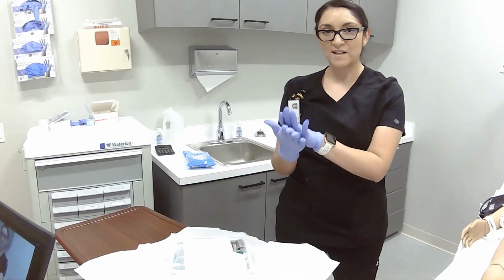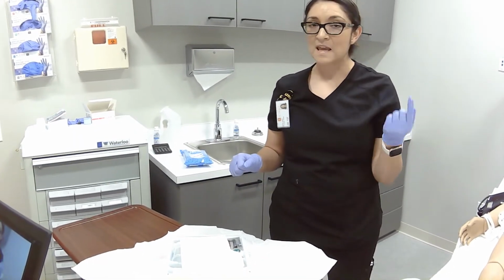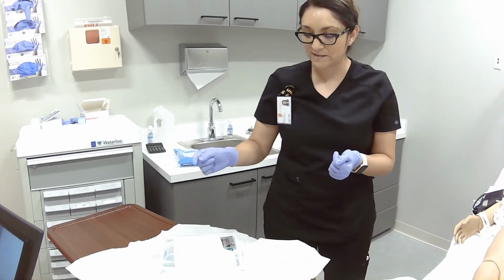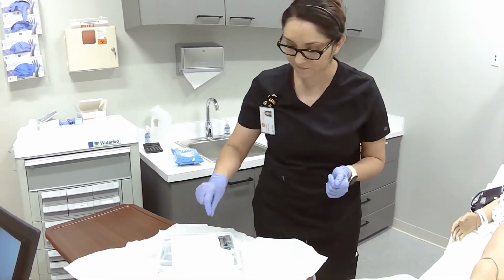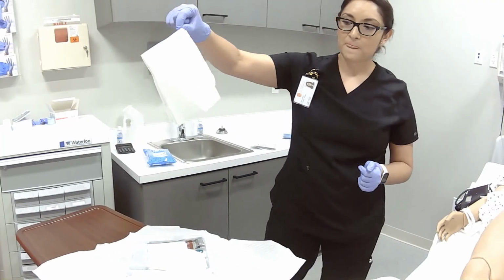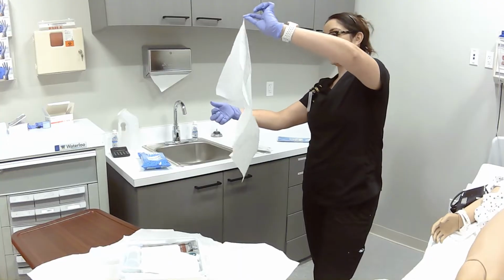So this drape is going to have a shiny side and a non-shiny side. The shiny side will be facing down. That drape we're going to place underneath the patient's buttocks, okay? And also important to note is your kits will usually have the supplies in the order that you're going to use them. So since the next step is to place this drape, that is why it's on top, okay? My sterile gloves will be underneath it, prompting me to become sterile. So I'm just grabbing it by the 1-inch margin carefully, okay? And I'm going to step back from my sterile field because I don't want to contaminate anything that is sterile that's in my kit, okay?